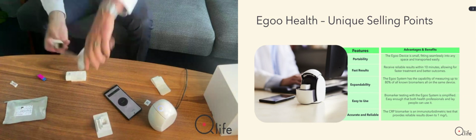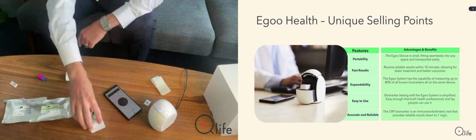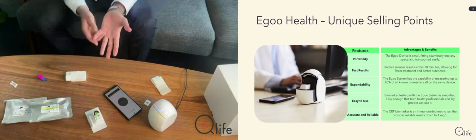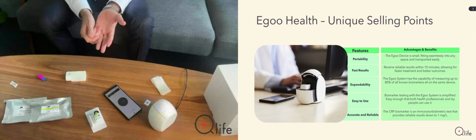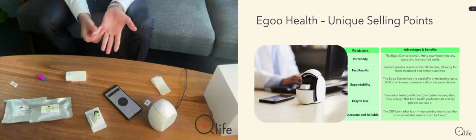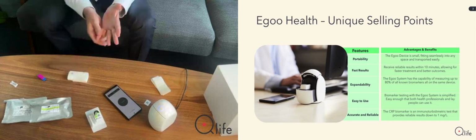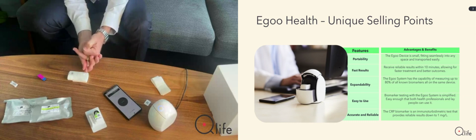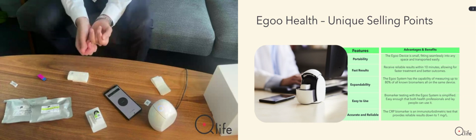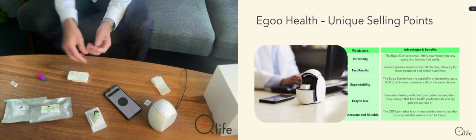It comes here. And I have this little tray also here to have the capsule in a nice place. You massage your finger a little bit because you need to have a good blood circulation in the finger to get a good drop of blood. It's important that you deliver the drop of blood directly on the white membrane here, if you can see that. And we basically just need 1 drop of blood. You can deliver 2, but 1 should be enough.